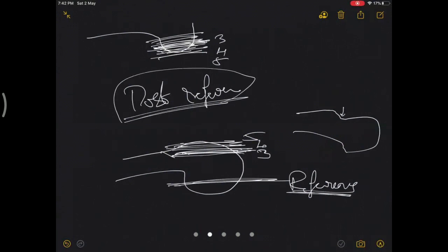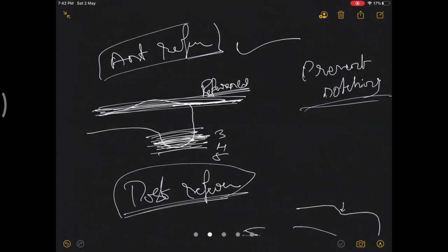The only theoretical advantage is that by downsizing it, you have some leeway, but if you do it too much, then the insertion site of the posterior cruciate ligament is at risk. If you downsize too much, then the insertion of the PCL on the medial aspect is affected in anterior referencing.